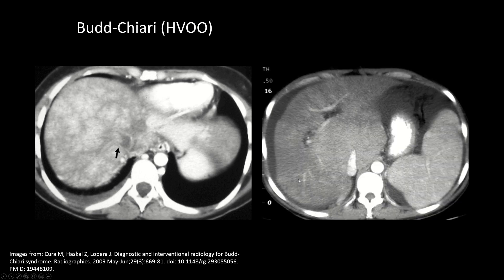This appearance can spare the caudate lobe, as the caudate lobe drains directly into the IVC. Over time you can get atrophy of the peripheral liver with significant hypertrophy of the caudate lobe for exactly that reason. This is a case of Budd-Chiari as well — notice the preserved and stronger enhancement of the caudate, which is very large, and the relative atrophy and hypoattenuation of the rest of the liver.